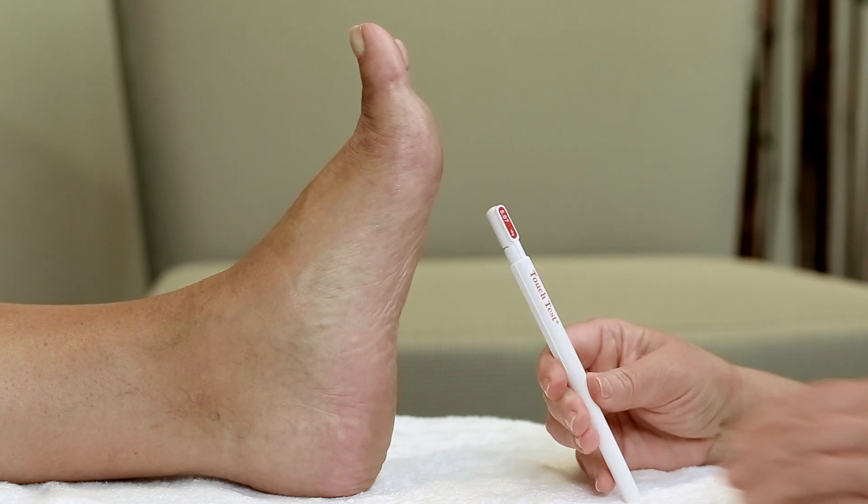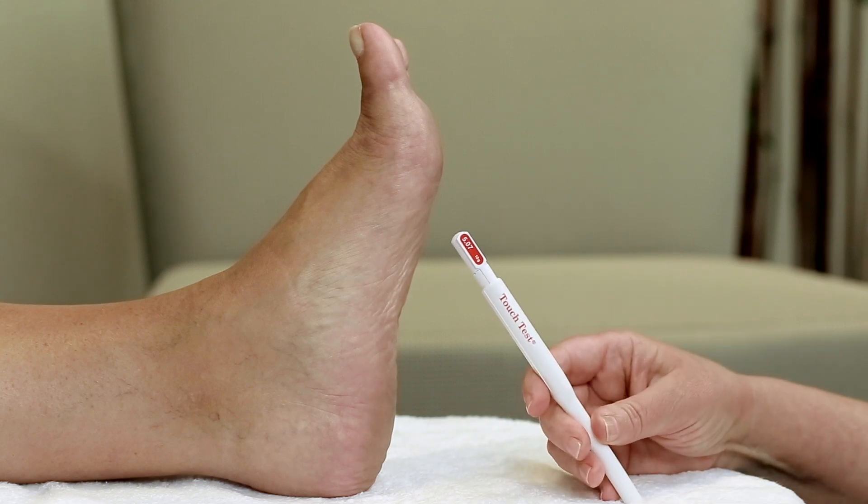You should contact your health care provider with the results. For questions on the use of the 5.07 Sensory Evaluator, visit our website or call customer service.